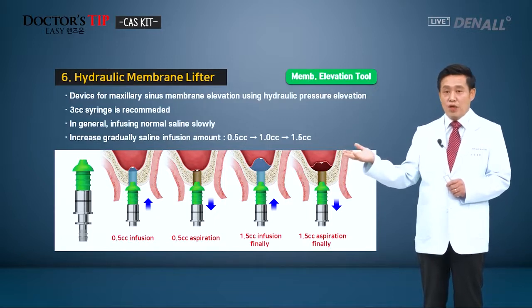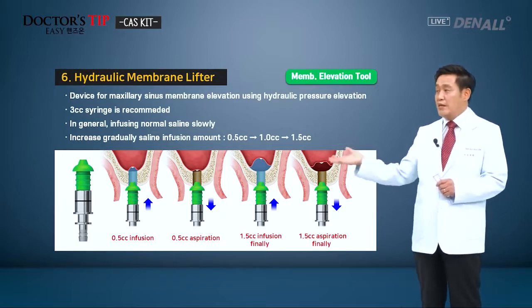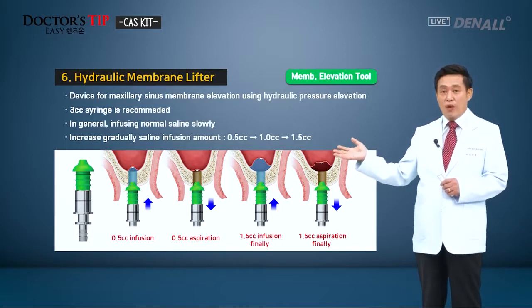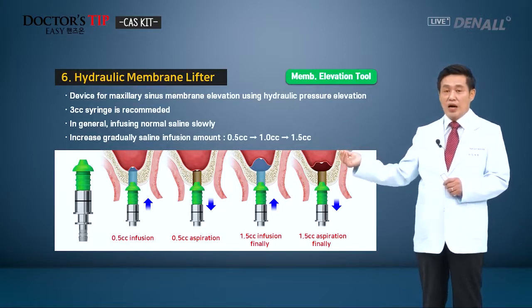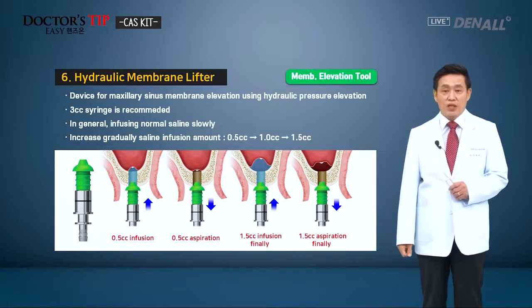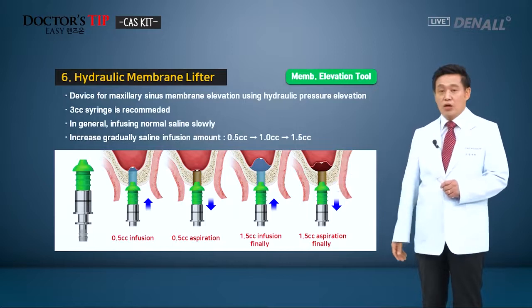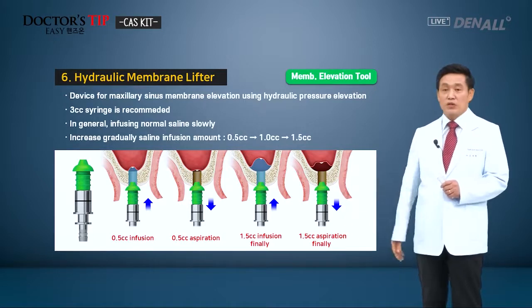If you lift the sinus membrane this way, the wider base sinus membrane can be lifted. After the bone graft, the bone formation can be made on a wider host bone base.